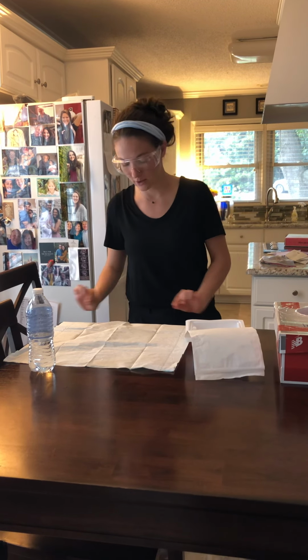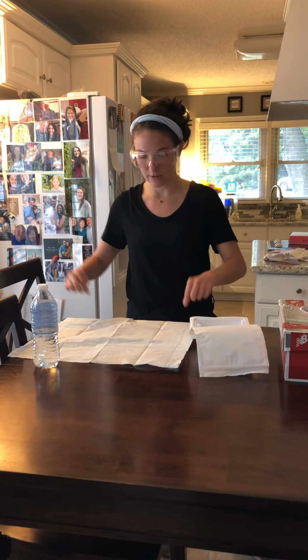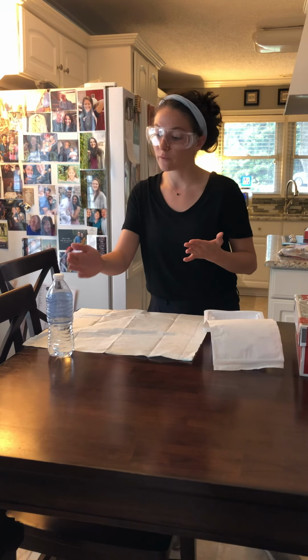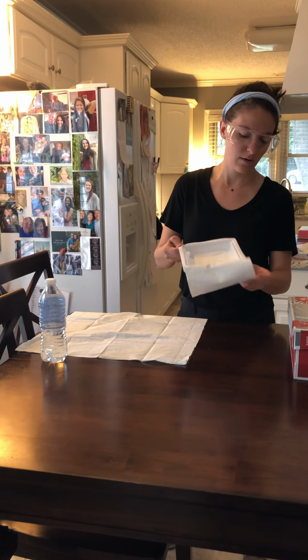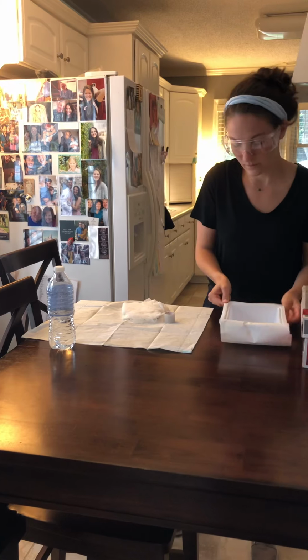So my sterile field is laying on my table, so my 1 inch border consists of everything that is on the table and a 1 inch border around it. When I was setting it on the table, only the edges of it touched the saline solution, so I did not break sterility. And now I'm going to dump this onto my field. Okay, it's still within the 1 inch border.